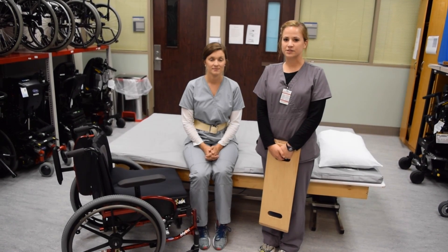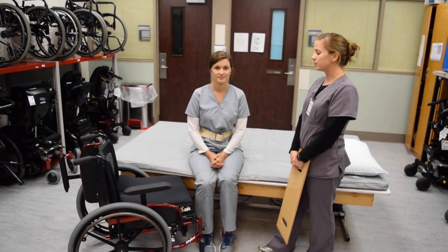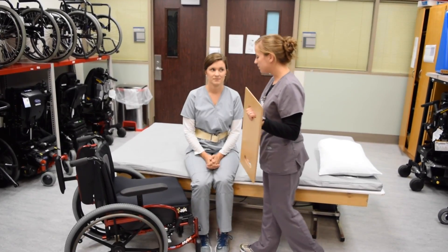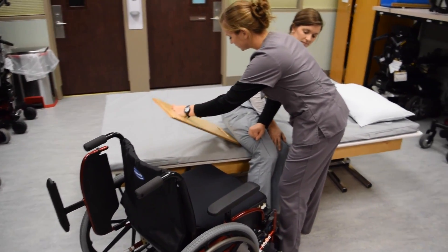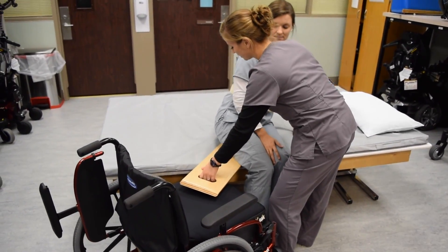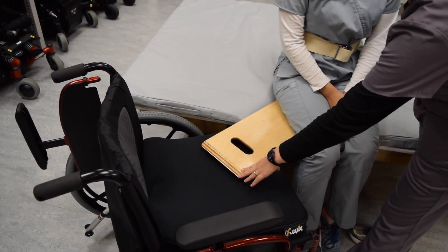When setting up for a slide board transfer, position the wheelchair at a 30-degree angle to the transfer surface to avoid transferring over the wheel. The armrest should also be removed to make the transfer easier. Position the sliding board under the patient by having them lean to the opposite side if they're able. You can use the patient's pant leg to assist with positioning the slide board and to avoid catching the fabric. Make sure about half of the sliding board is under the patient and half positioned onto the wheelchair, directed towards the center of the wheelchair.